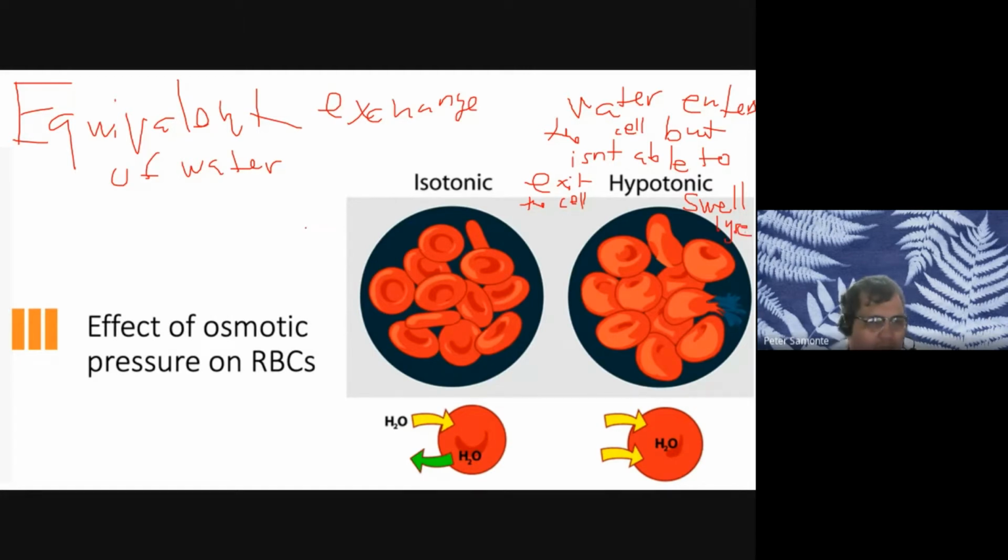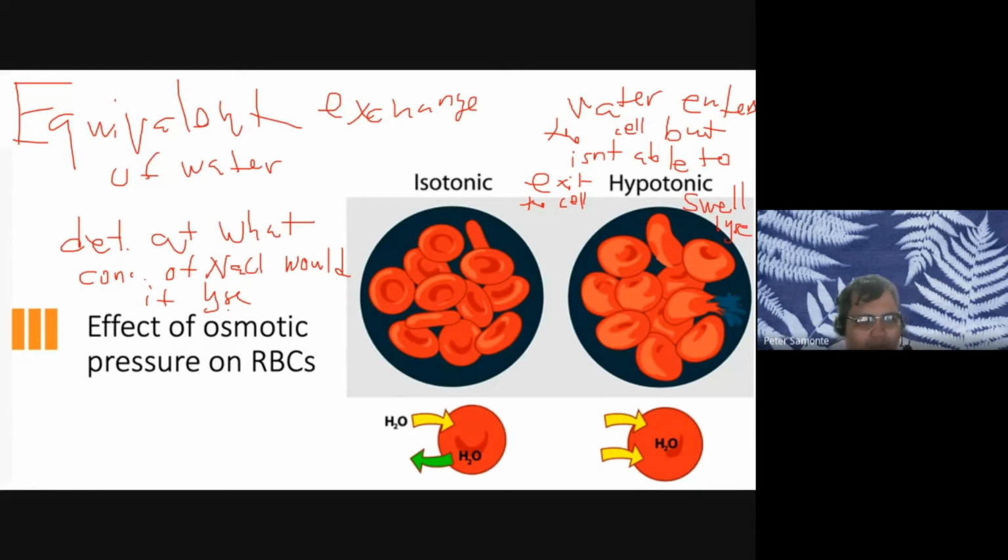Now, in your osmotic fragility test, class, you're going to determine at what concentration of NSS or sodium chloride it would lyse. So, gaano ka-resistant, class, to osmotic pressure, at what concentration ba yung kaya niya na i-resist yung swelling.